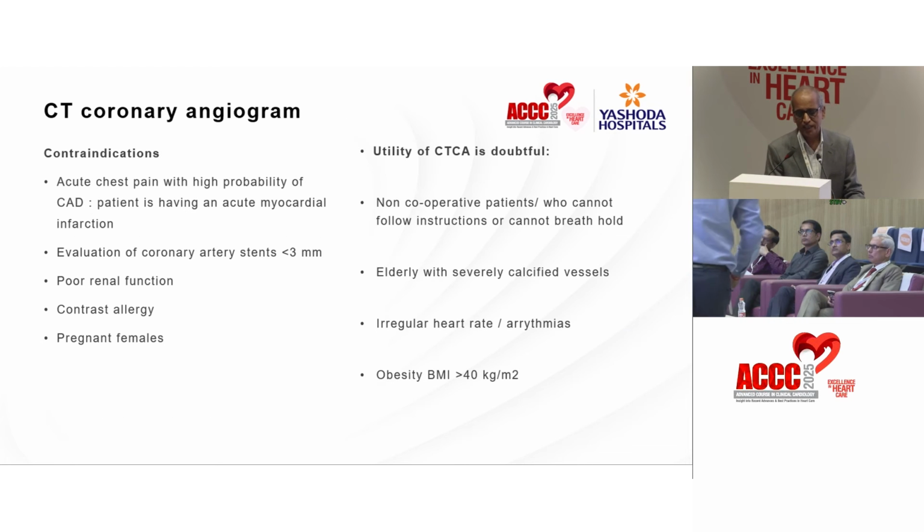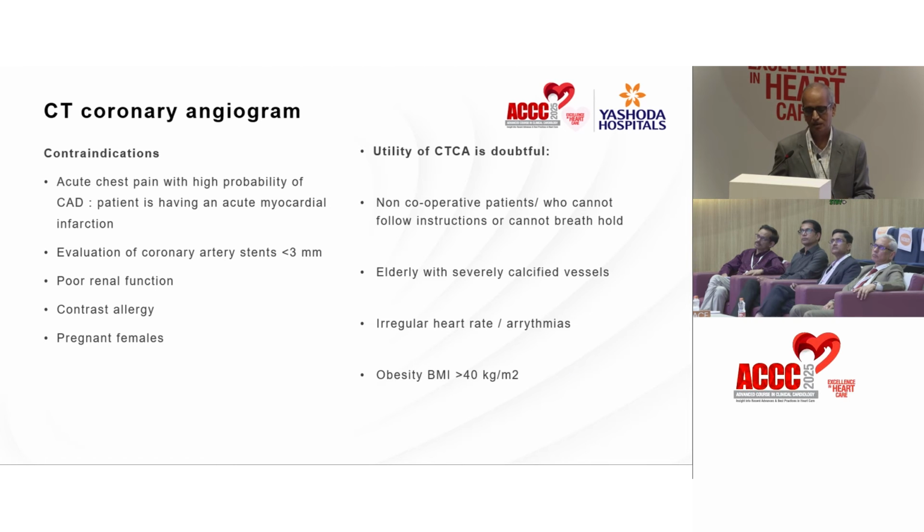Now, there are contraindications for CT coronary angio. You have an acute chest pain with high probability of coronary artery disease. They don't come for CT coronary angio. They go straight for an invasive catheter angiogram. Evaluation of coronary stents less than 3 mm is not good enough. Poor renal function, contrast allergy, and pregnant females. These are, again, contraindications for performing a CT coronary.